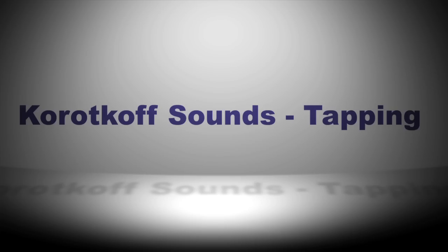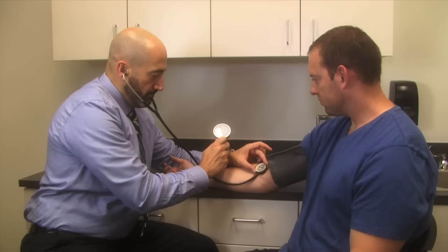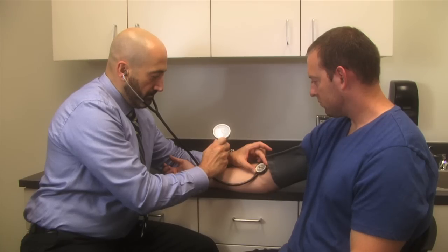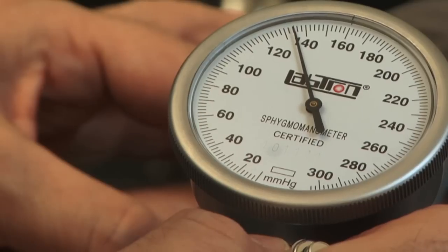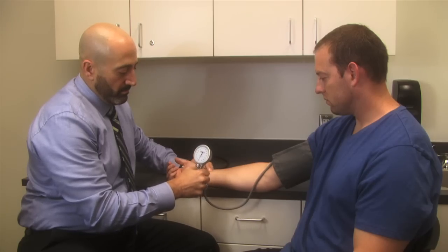Korotkoff sounds change throughout the blood pressure measurement cycle. They first appear as soft tapping sounds that get a little louder, then turn into a thud, become more muffled, and finally disappear. Korotkoff sounds actually have five phases with four unique sounds. This is why it's important to listen with the bell of the stethoscope, and to be in a quiet environment — the first sound comes in soft and tapping and can be challenging to detect.